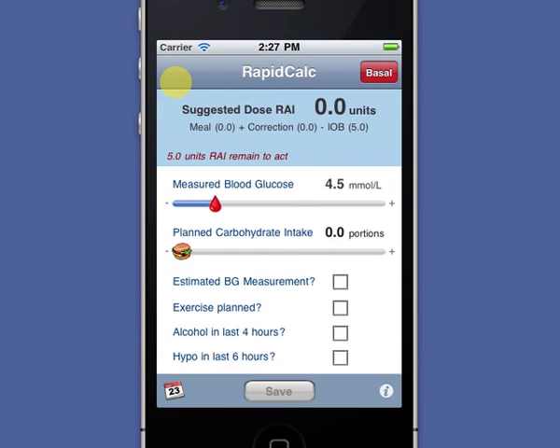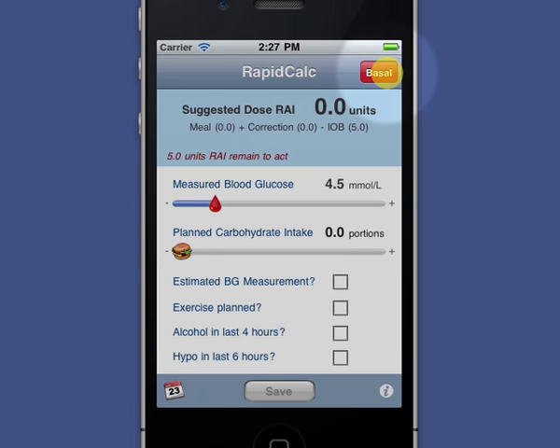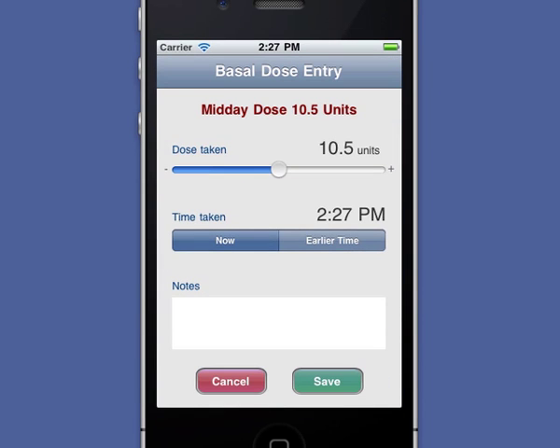Basal dosing is just as easy. When I open RapidCalc, the basal button will be highlighted red if a dose is due. My standard dose for this part of the day has already been preset, so unless I need to change the dose time or add a note, I just need to touch save and I'm done.